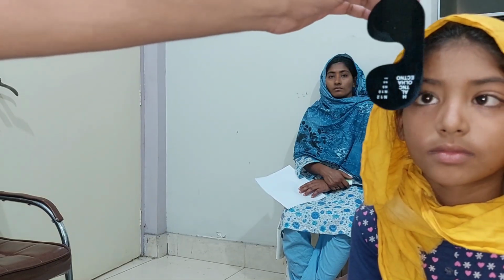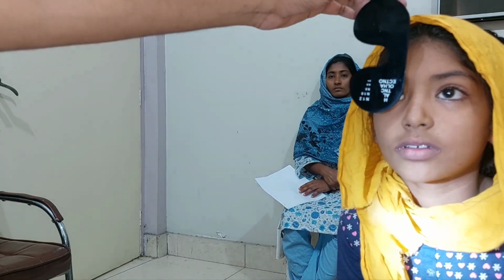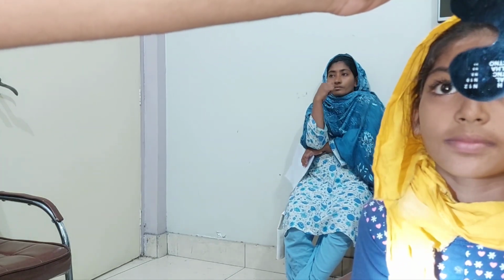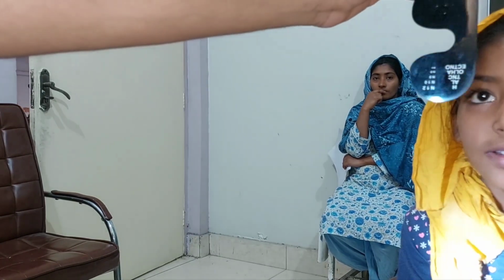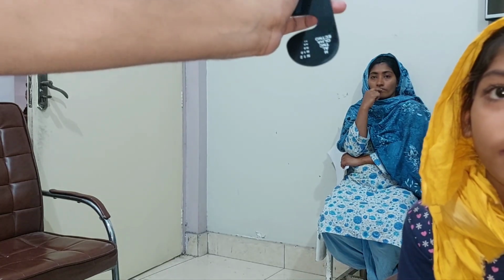Sir, do it again. You see, when you cover the right eye, the left eye is straight. But when you alternate, the eye is coming from up to down. So what is the differential diagnosis that comes to your mind? Which is the condition in which the eye comes from above down? You have differential diagnosis of DVD, inferior oblique overaction and hypertropia.